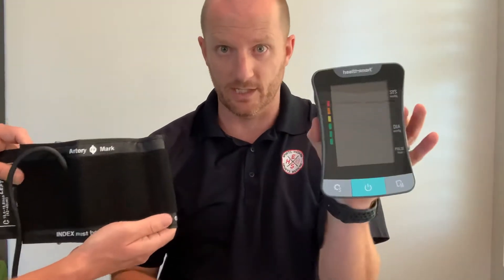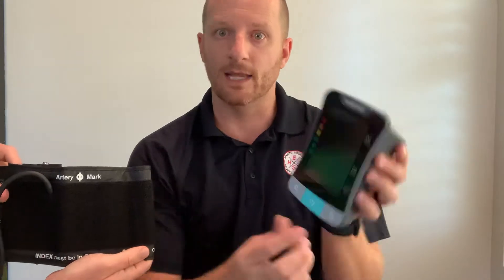Then I'm going to take this wire and plug it into the machine, push the blue power button, and it's going to give me a digital blood pressure reading.